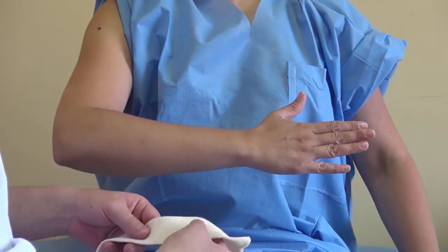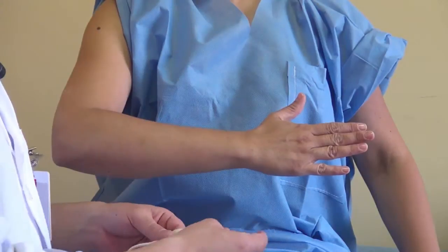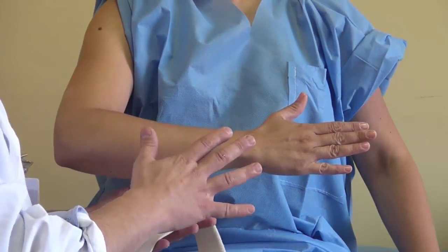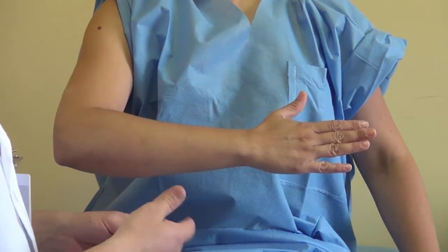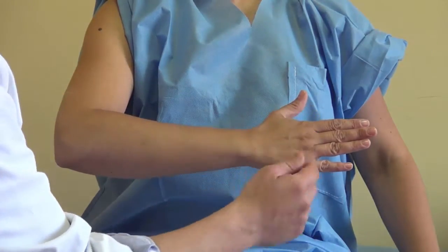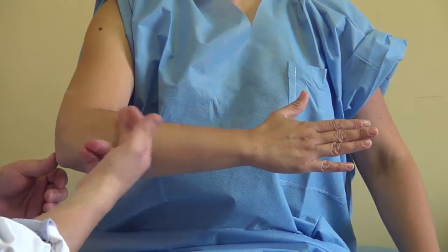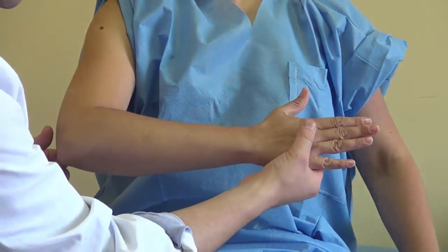The first thing we're going to show is a normal splint that we use to treat non-displaced fractures, to keep it in one position and to relieve pain in patients that have a fracture. This splint goes from the tip of the metacarpal down the arm, going around the elbow, and back to the metacarpal area.